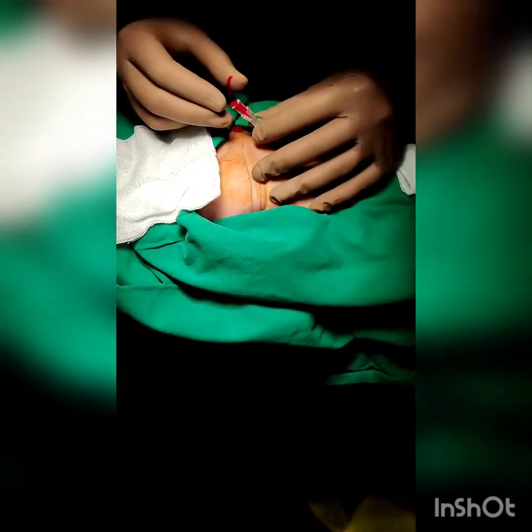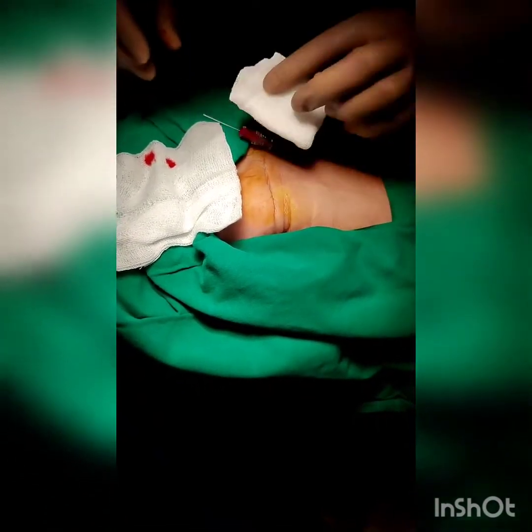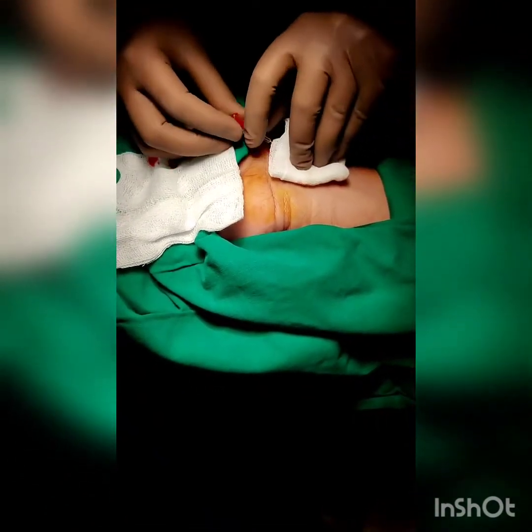As the needle enters the artery, a flash of blood is seen at its distal end. The flexible straight end of the guide wire is then advanced into the artery through the introducer needle.